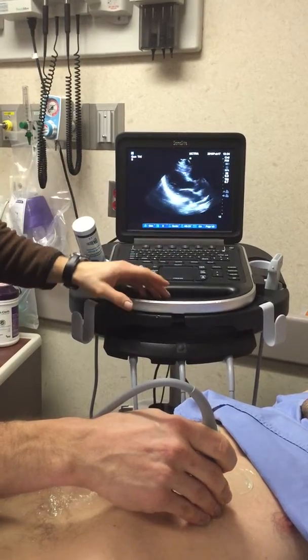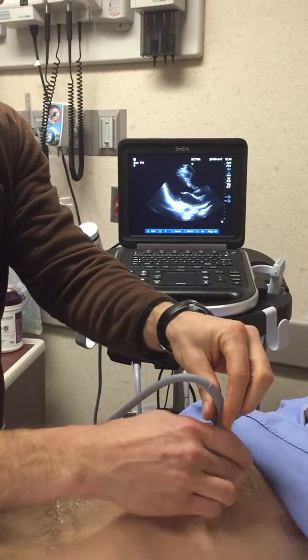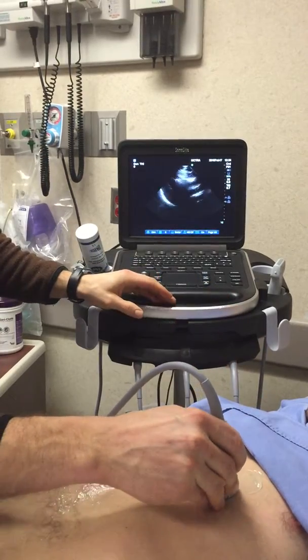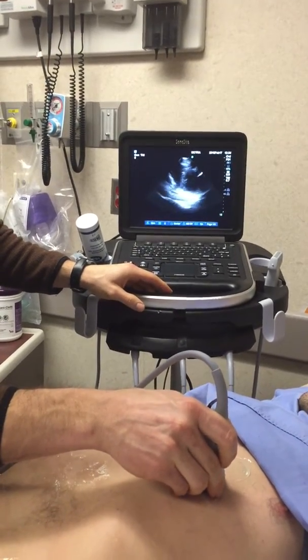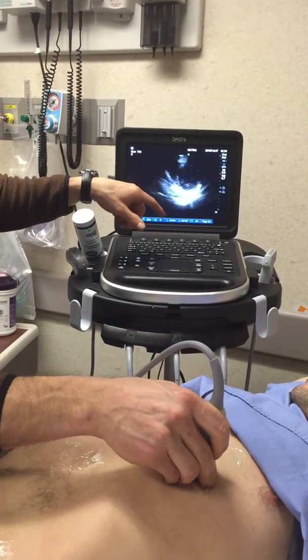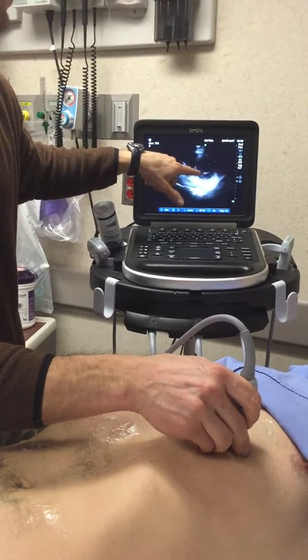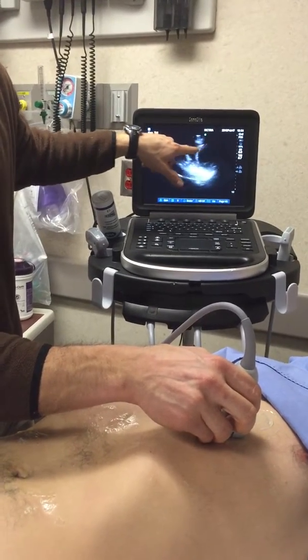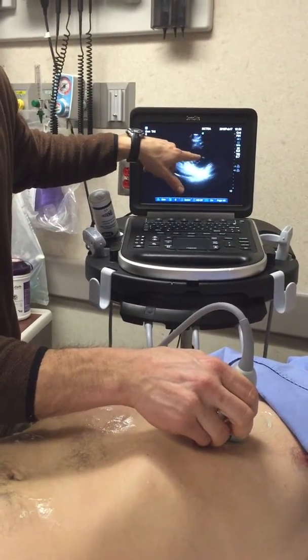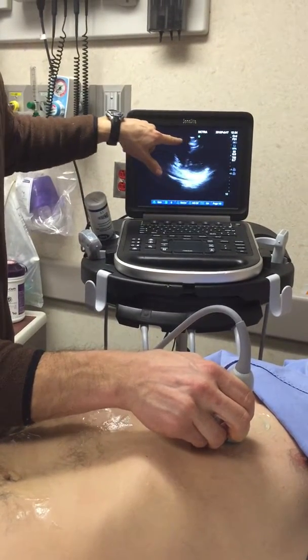From that standpoint, then you move to the parasternal short. So I'm moving about 90 degrees or 45 degrees to the patient's left shoulder with the indicator there. And you usually want to find a donut view, fish mouth view, they say, with the mitral valve right in the center of the screen. And so you want to picture that left ventricle squeezing to an imaginary point right in the center. You can see the right ventricle on the outside here.